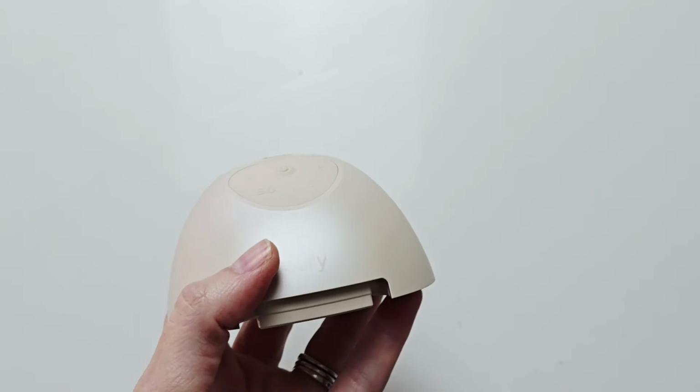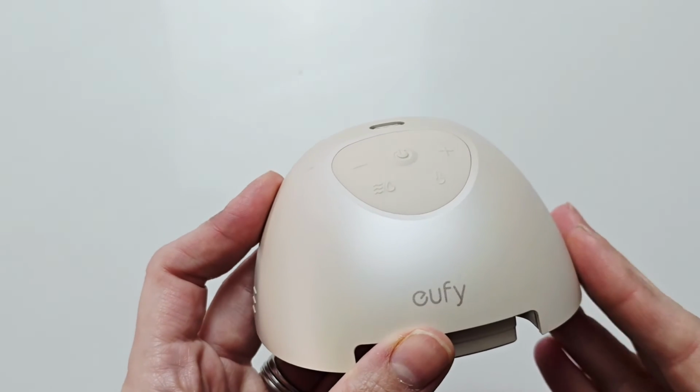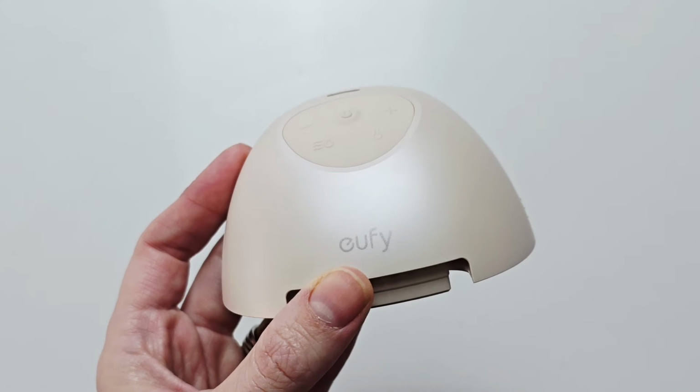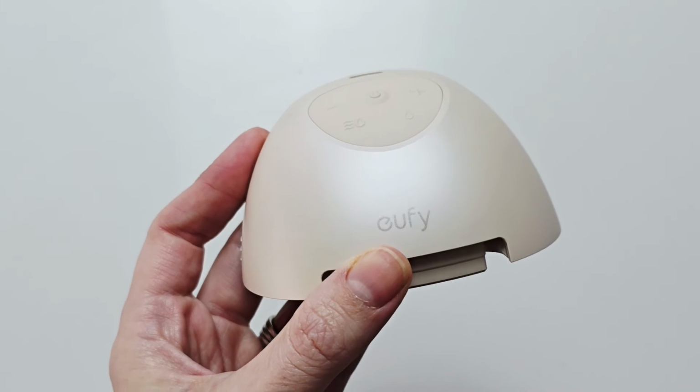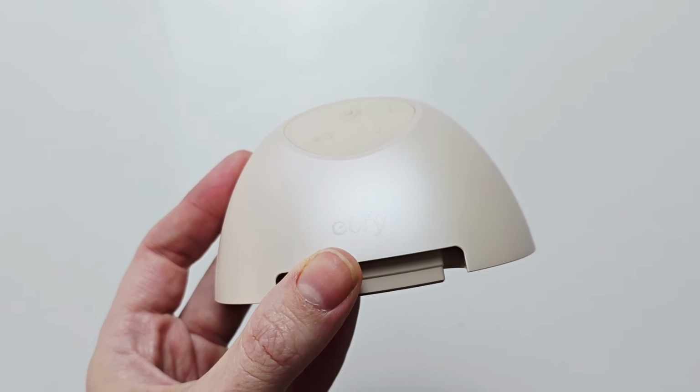And then finally, you have your pump motor. Now, Eufy don't actually highlight how long your pump motor will last. Eventually, like all electronics, the pump motor will die. It should though, however, most wearable pumps are around the 500 hour mark.